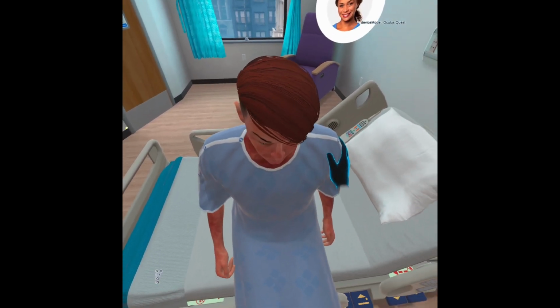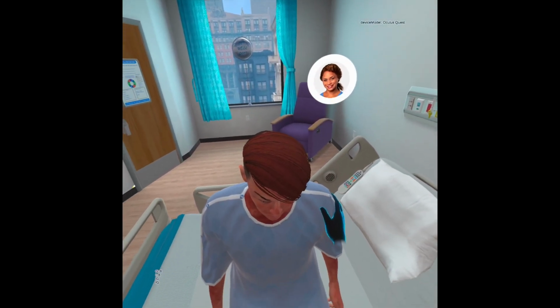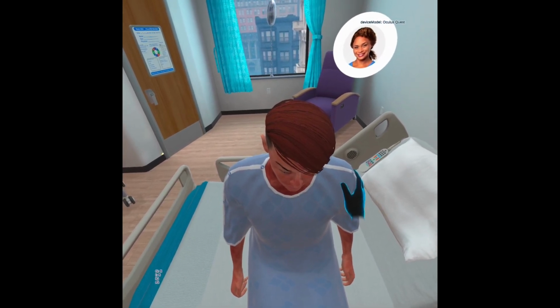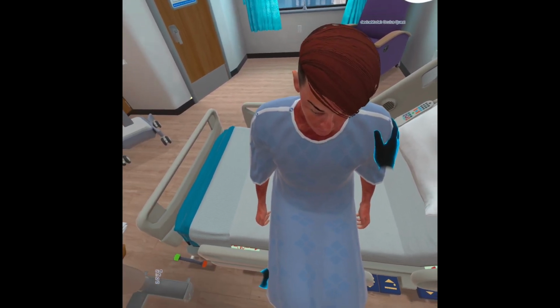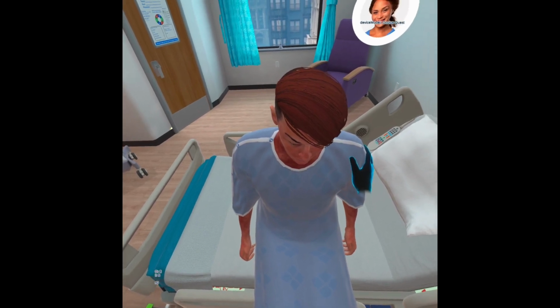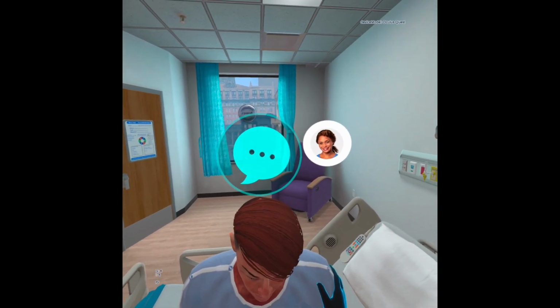Give Riley a moment to adjust to this change. Changing position can alter some patients' blood pressure, so allowing them time to adjust before removing your hands or moving the patient to the next position can reduce risk of falls. Continue holding Riley with one hand and ask him if he's dizzy.